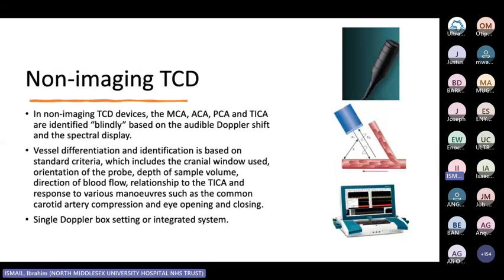I went with a laptop and a Doppler box to different hospitals in the UK, and I was able to provide good, accurate, and replicable results across different centers, rather than transporting a whole ultrasound machine across different trusts, which would not be very ideal.